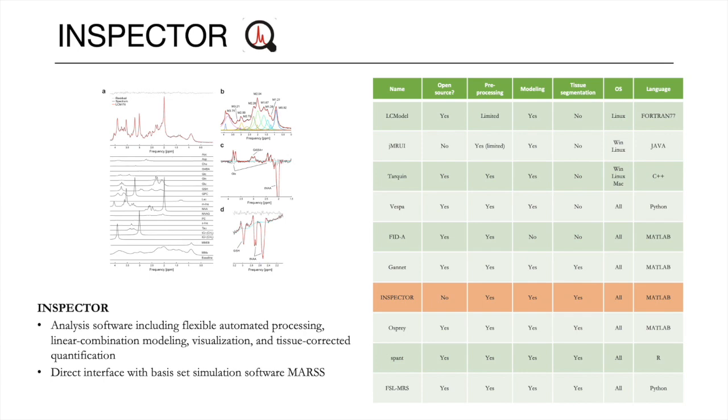The next 4 tools have all been released within the last 2 years and are almost complete solutions covering the entire workflow in a modular way, often encouraging users to implement their own workflows within them. Inspector covers all the bases, including fully automated processing, modeling, quantification, and visualization, and it directly interfaces with a simulation software.